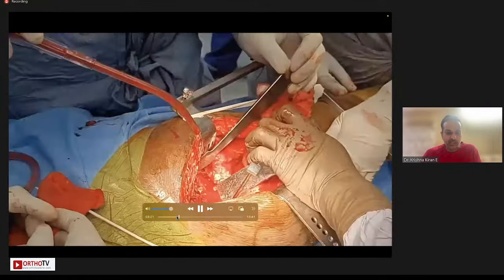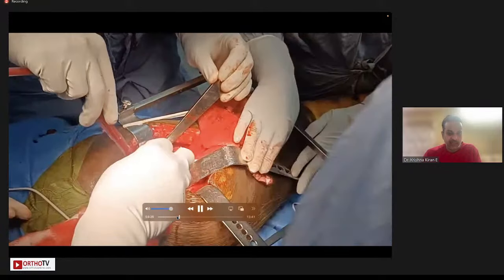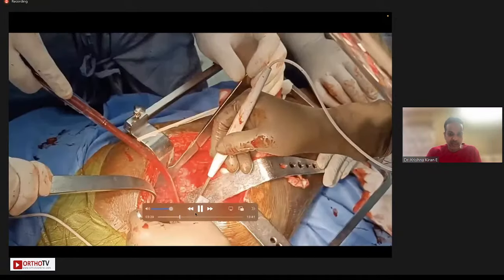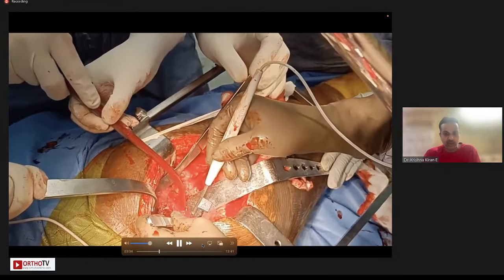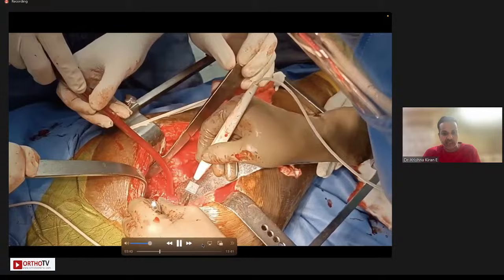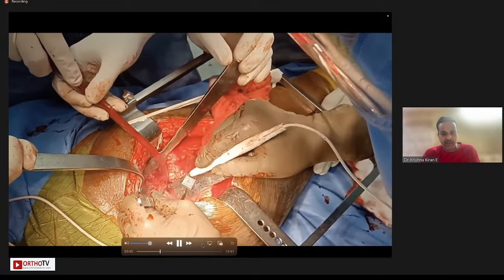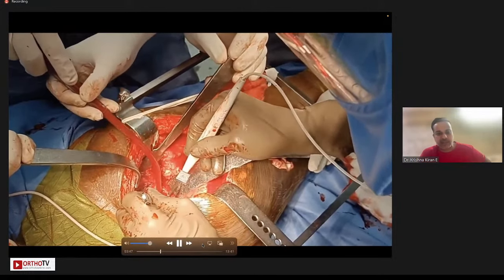And that allows us to expose the acetabulum 360 degrees. And the inferior retractor is beneath the transverse acetabular ligament. And this allows us to remove the fibrous tissue and all the things. And in some cases, we can also identify the transverse acetabular ligament, which sets the inferior position of the cup. Instead of putting a high hip center, you can put in the native hip center. So this inferior retractor is very, very important.